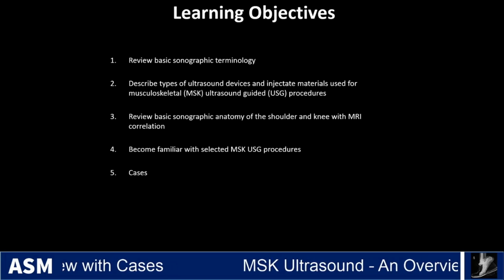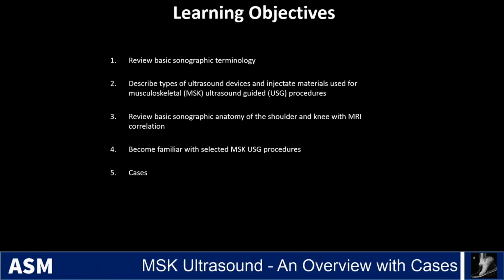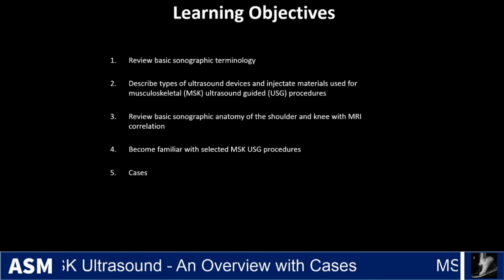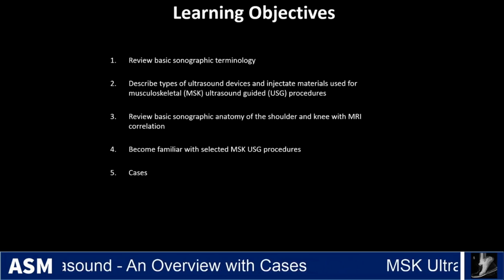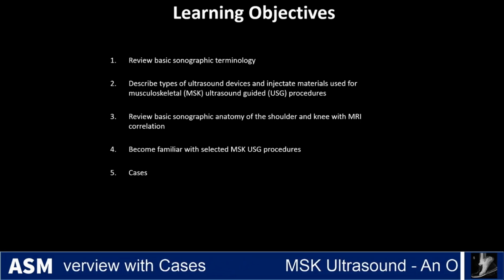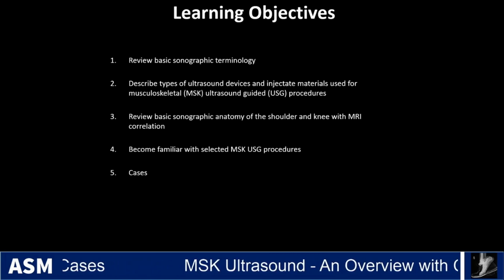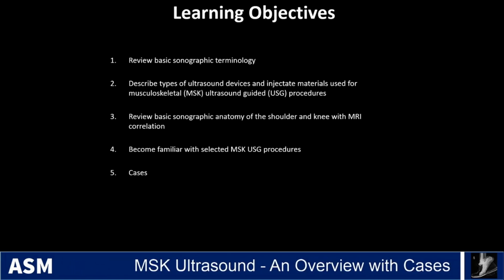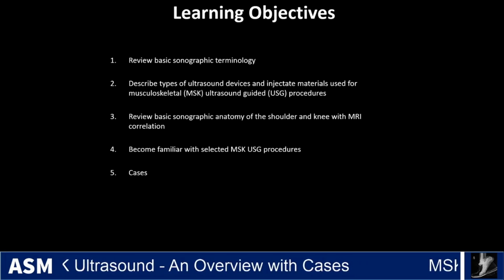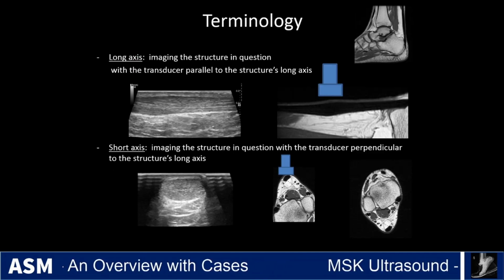I am going to have a citation list at the end to see some of the places where the evidence comes from. This is a brief overview, so I can't delve too deeply into the evidence behind all of these procedures, but there will be a couple of quick summary bullet points at the bottom of each slide section, and then the references at the end. I would encourage anyone who's interested to take a look at some of these sources and even further peruse the literature just to get an idea of how effective some of these interventions are and what the evidence is behind them. So we'll start with the terminology.